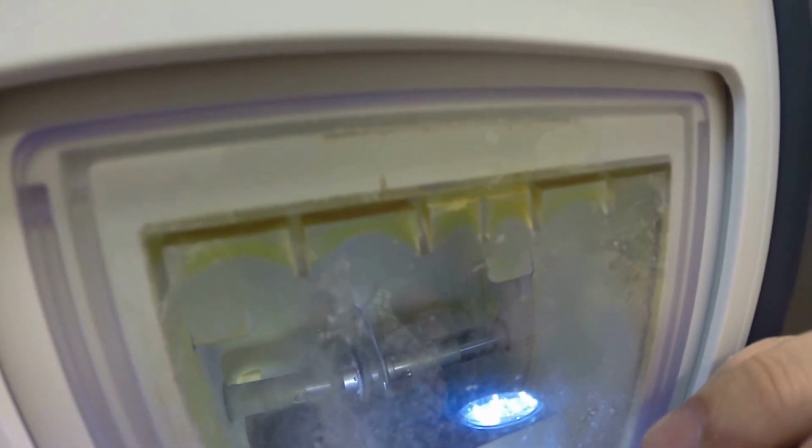Now in just a moment the lens is going to drop down onto the cutting wheel. And I wish I had cleaned the wheel in advance so you could see this. I apologize if you're missing any of that. If you see light flickering in the background, that is water there to catch the optical sawdust as it comes off of the lens. Polycarbonate lenses cut dry, while plastic and high index plastic cut wet, as well as Trivex. So now your lenses are cutting.